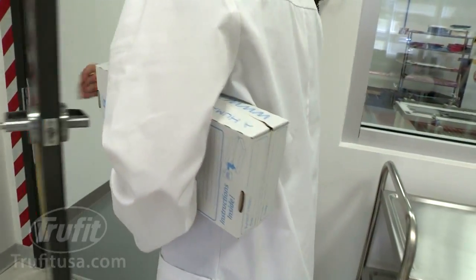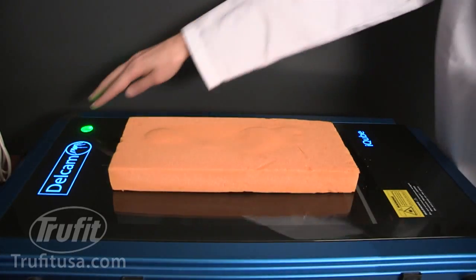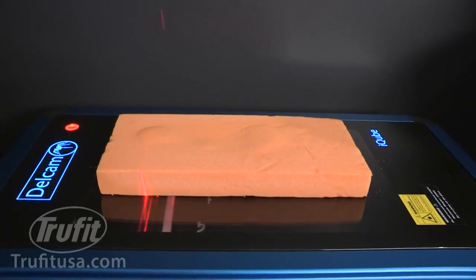After we receive the patient's foam impression from you, a TrueFit technician scans the impression to generate a virtual three-dimensional replica of the foot.